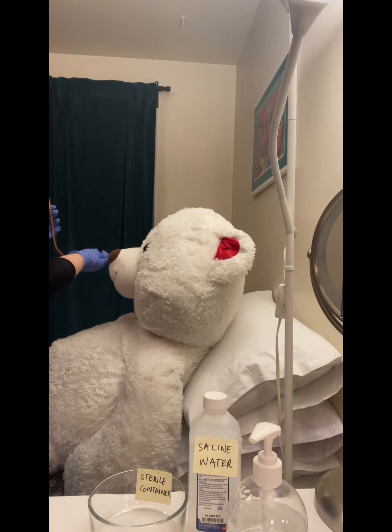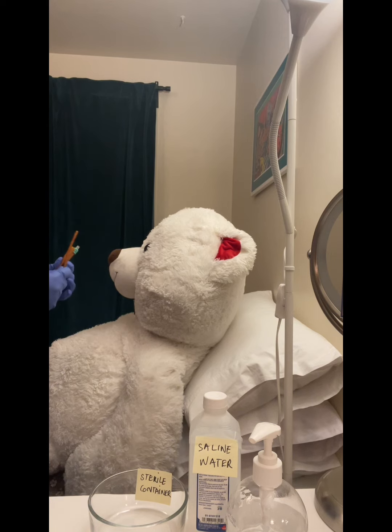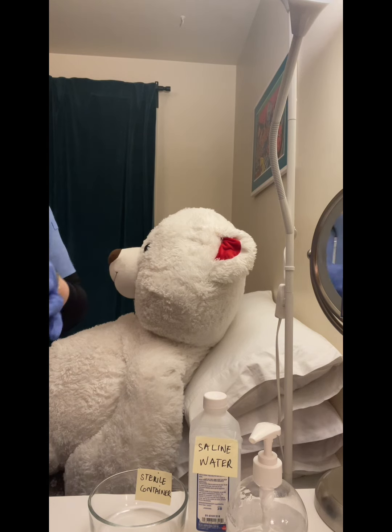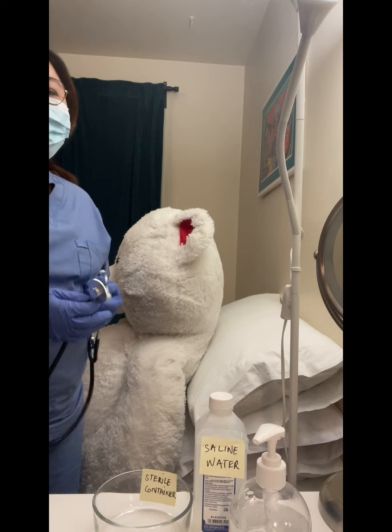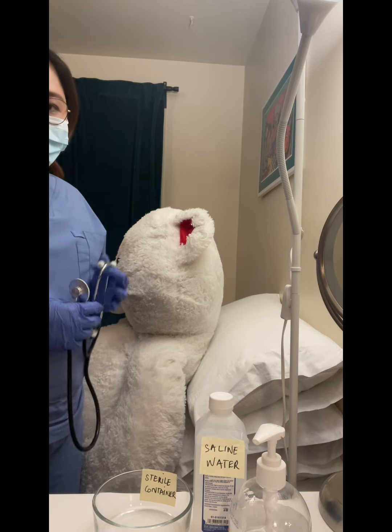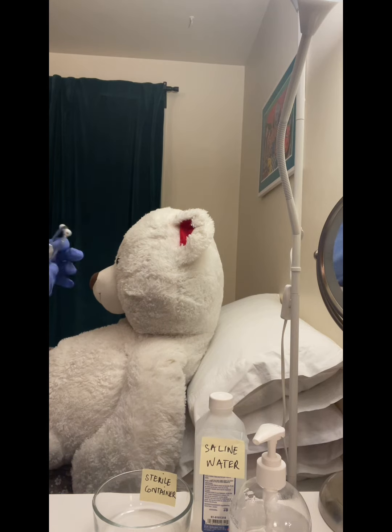And after suctioning the nose of the patient, we have to immediately dispose of the suction catheter and replace the tip connector onto the suction tubing. Then turn off the suction unit. Next is to assess the effectiveness of the suctioning, and then I will auscultate the patient's breath sounds. So I will start to auscultate now.